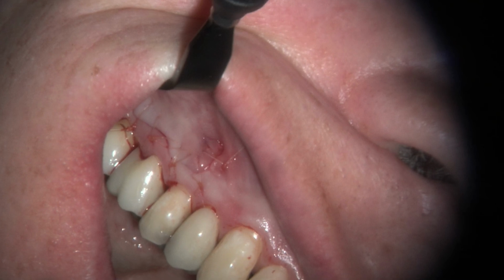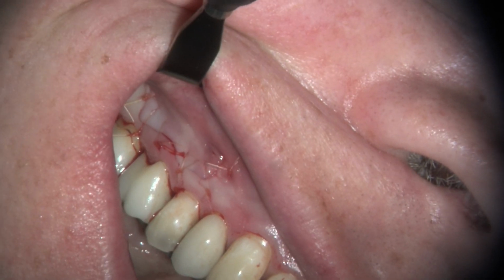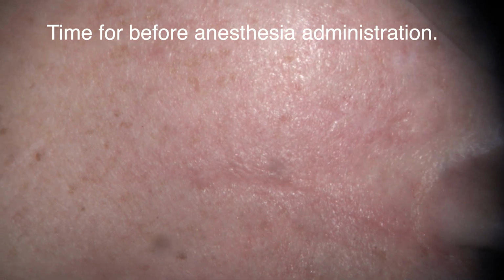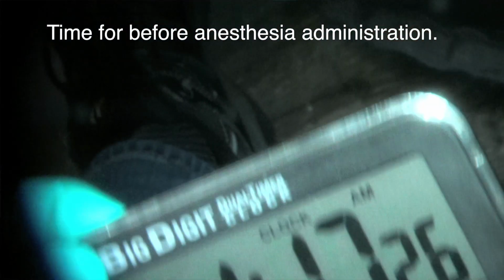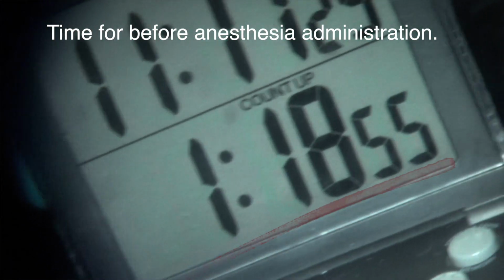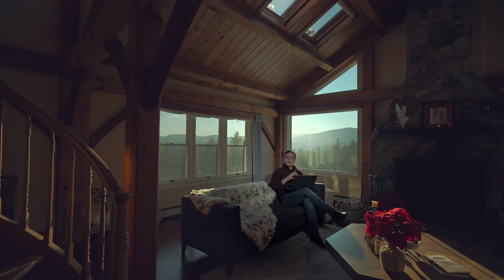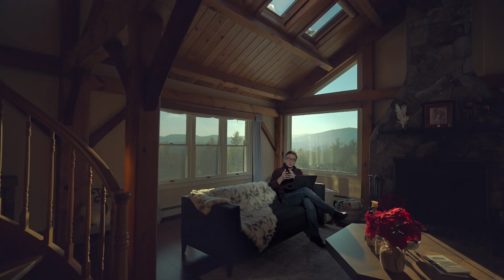And as you can see here, after I'm done, I always use a timer to measure the time of my entire procedure. From the time the patient comes into the chair, I count the time all the way to when they leave. We've done the revision through the crown, and we did the apico surgery and the sutures. We called the patient the following day, and the patient actually had absolutely no pain at all. And that's what's wonderful about surgery.